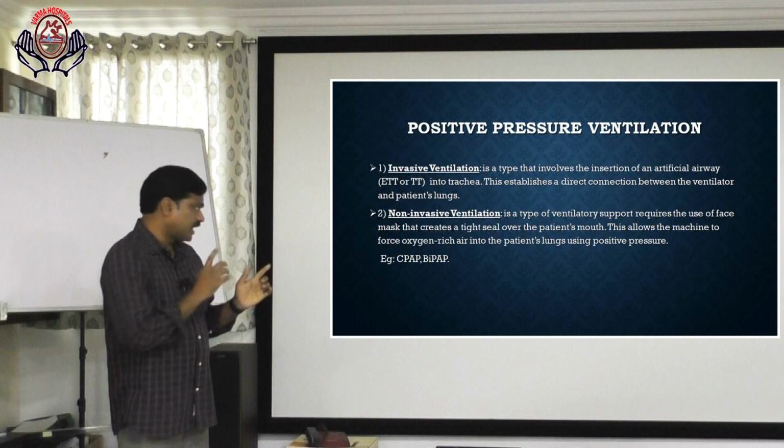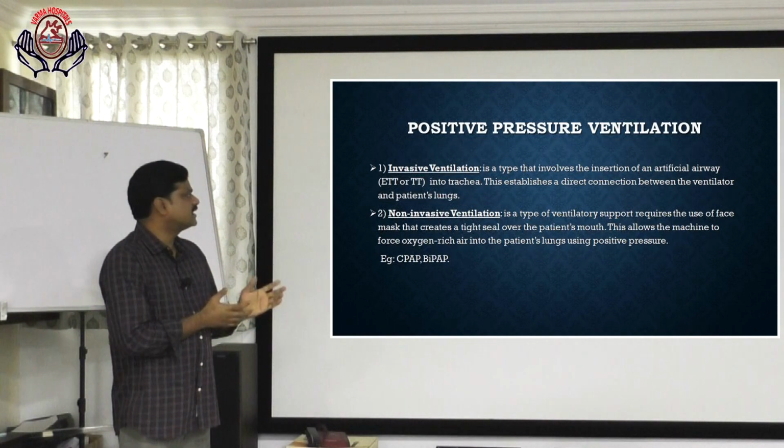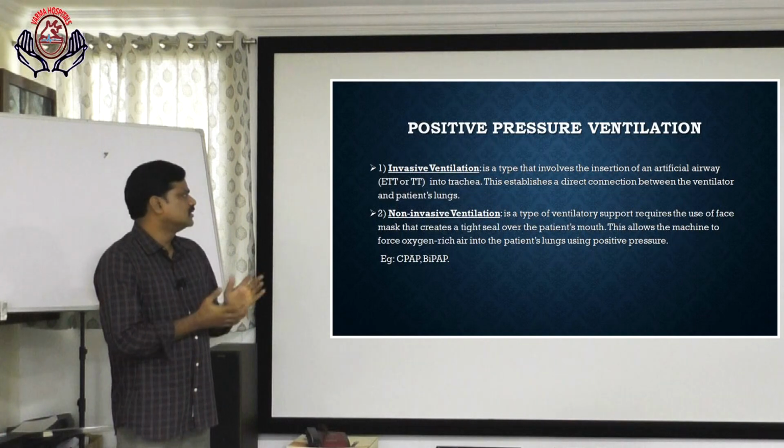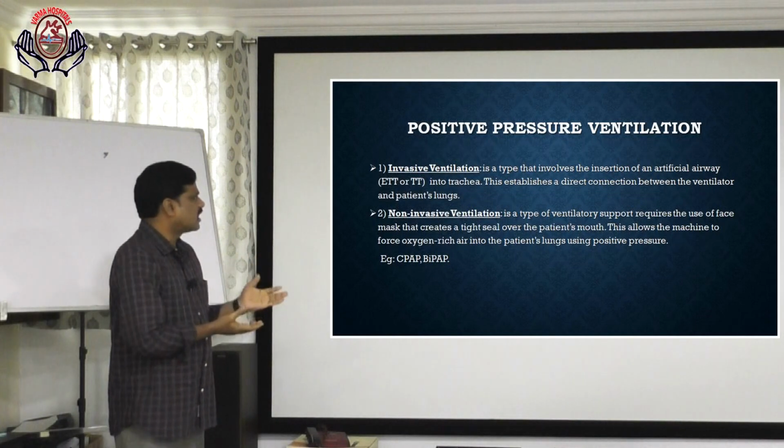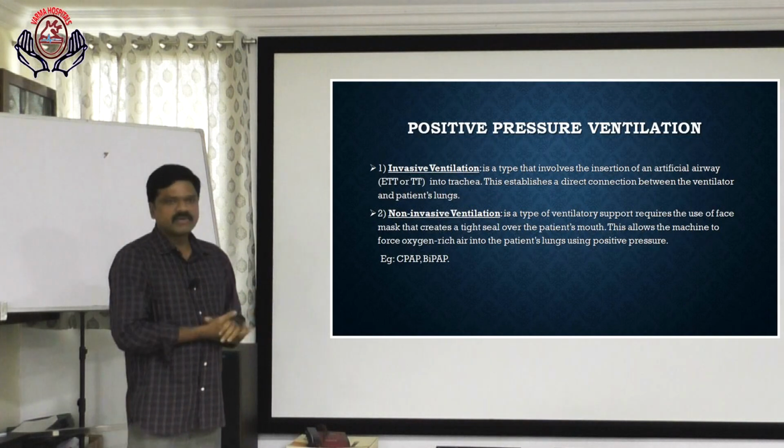Non-invasive ventilation is a type of ventilator support that requires the use of a face mask that creates a tight seal over the patient's mouth. This allows the machine to force oxygen-rich air into the patient's lungs using positive pressure, for example CPAP and BiPAP.